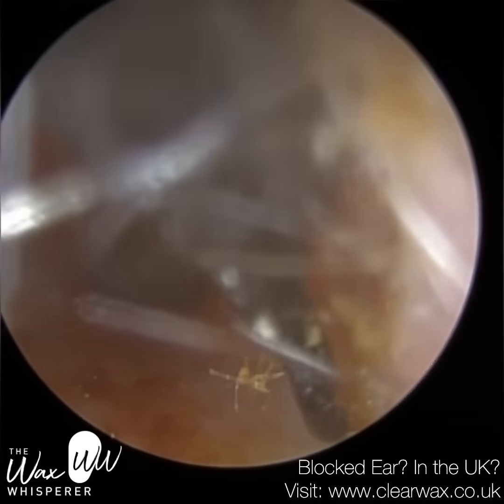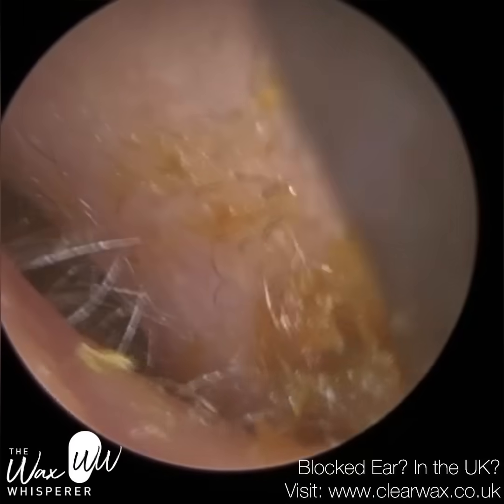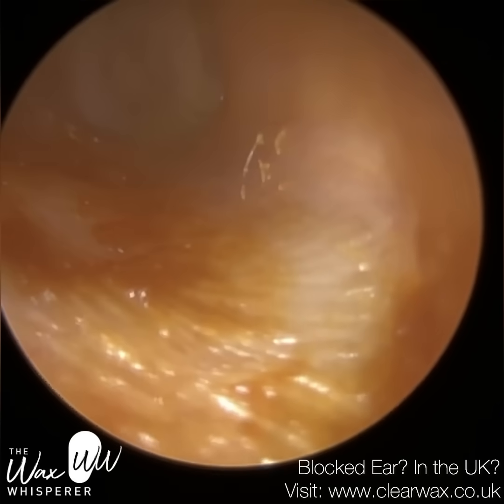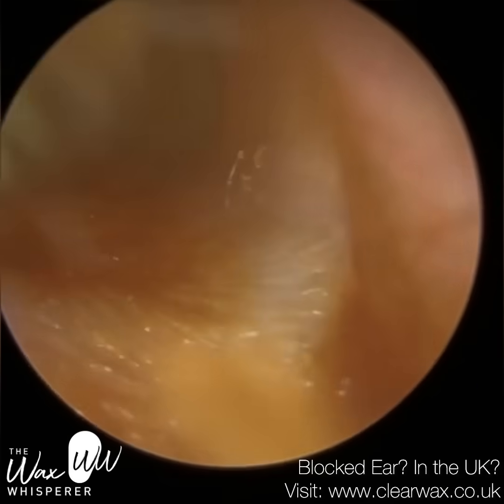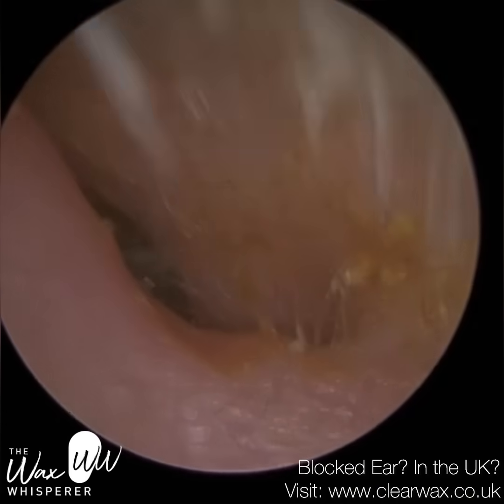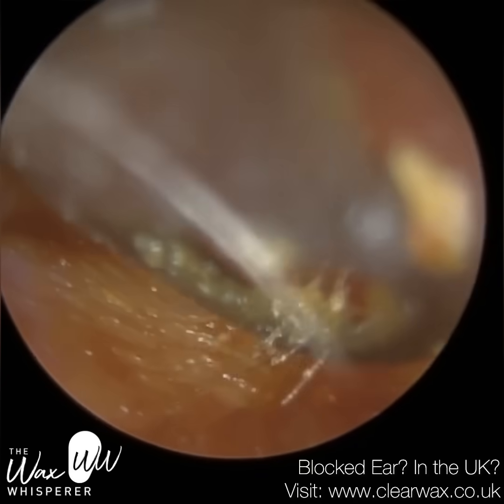So the patient themselves noticed a difference in the treatment they were receiving — it was all very positive, and I'm really thrilled by how well this procedure went and how well the Rykerette performed. You are going to get some natural surface wax; we're not going to try and scrape and remove that, because by scraping the ear we're going to cause more trauma. A bit of wax is good for you. I did also mention that in video 1297. I sometimes receive emails from disgruntled viewers who are not happy if I leave a bit of wax, feeling I don't know what I'm doing. So guys, please be kind — a bit of wax is good for you.